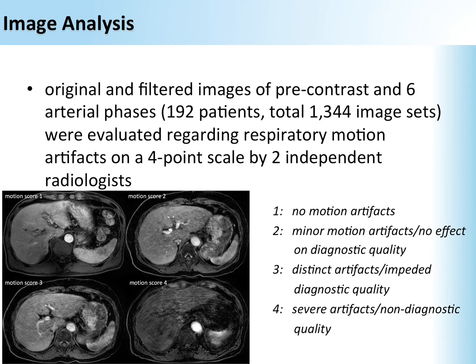Afterwards, two independent radiologists saw the original and the filtered images in the pre-contrast and dynamic arterial phases in 192 patients. And they evaluated it regarding the occurrence of motion artifacts. And they rated the diagnostic accuracy on a 4-point scale.